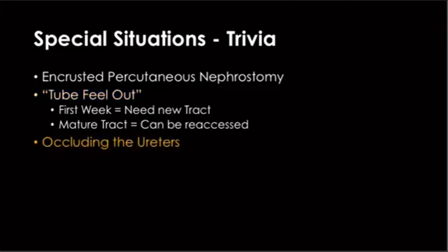Alright, so you may have seen the ureters occluded, like by IR, like actual occluder devices stuck down in there, and you may say to yourself, why are they doing that? So urinary occlusion may be necessary in addition to urinary diversion in patients who have urinary leaks or fistulas or urinary incontinence or intractable hemorrhagic cystitis.